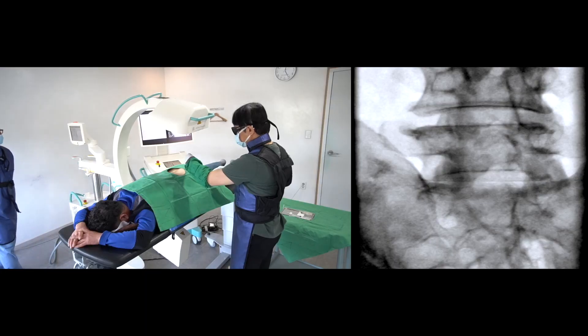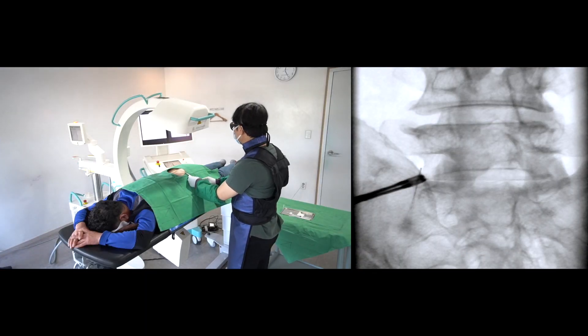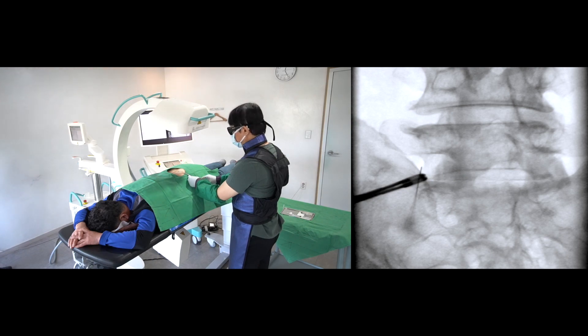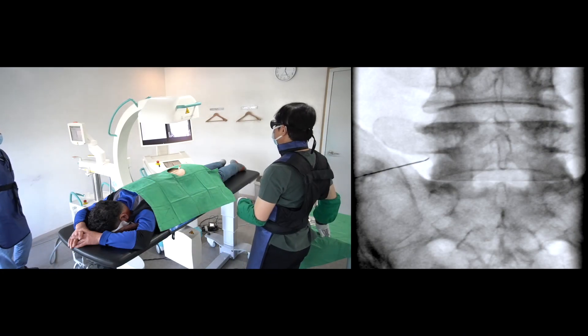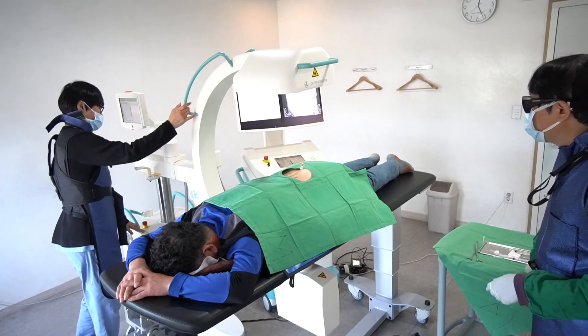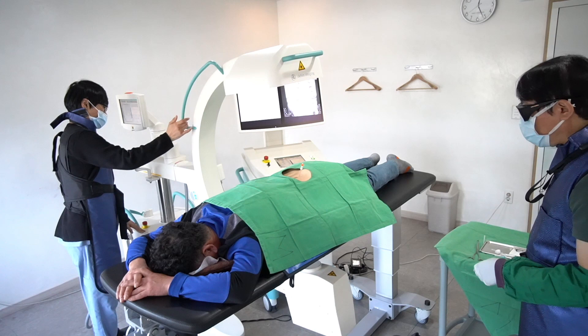I'll introduce the needle through the Ipsilateral Oblique image guidance. Then rotate the C-arm to AP view. I can assess the needle depth and position with two different angles of the stereo views.